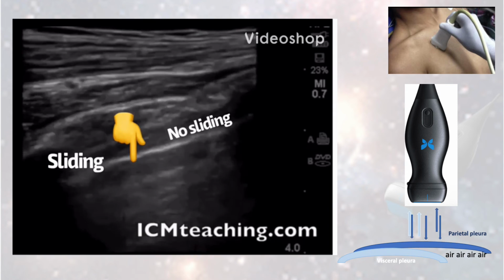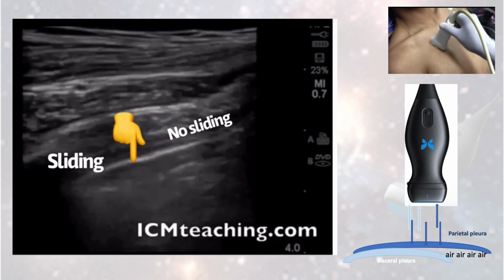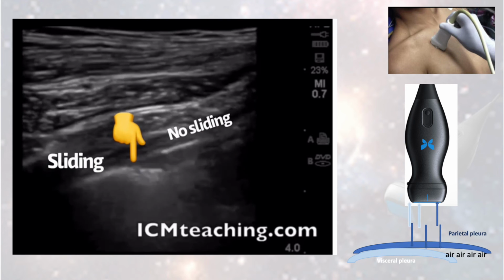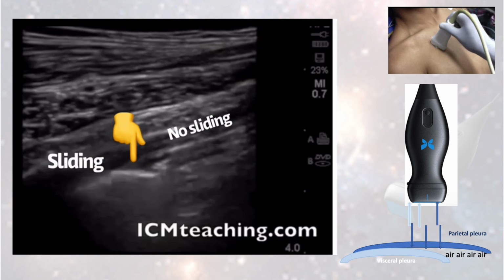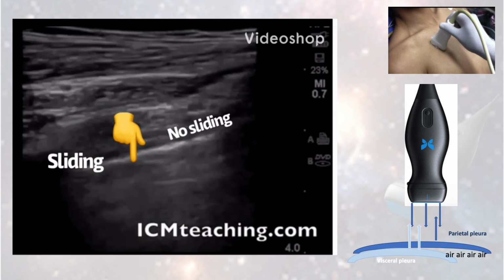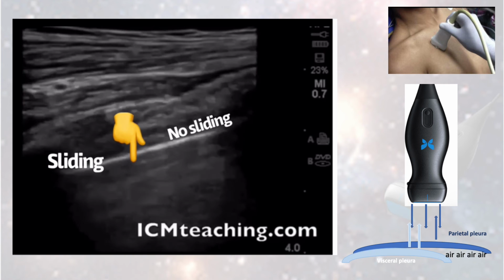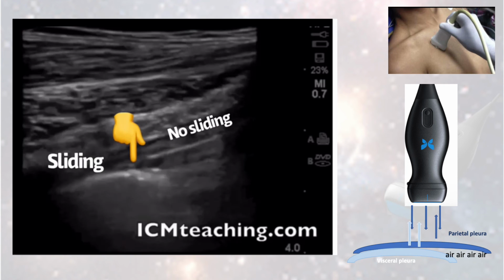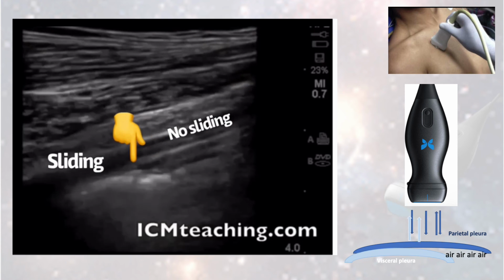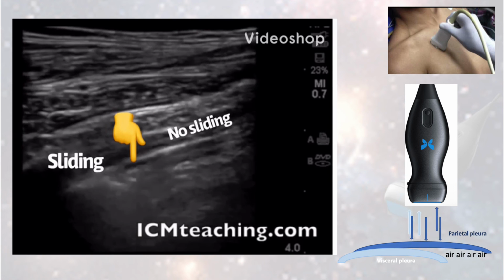Lastly, if you do a careful ultrasound examination, you might be able to see a sign that is 100% specific to pneumothorax and virtually diagnostic. It's the lung point sign. Lung point is where the visceral pleura is stripped off the parietal pleura because of air. Part of the pleural line will show normal sliding, and the other part will show absent sliding. The more lateral the lung point is, the larger the pneumothorax.